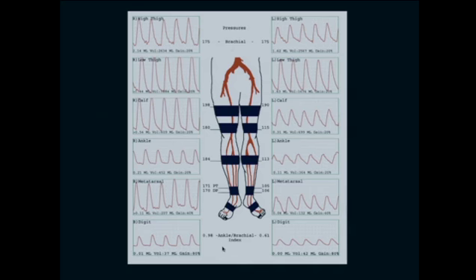In this patient, we see that the ankle brachial index on the right is 0.98, which is close to normal, but there is a significant reduction in the ankle brachial index on the left, which is seen here to be 0.61. When we review the segmental pressure measurements, we can see that there's a significant reduction in pressure across the left thigh level, and pressures remain decreased as we move down the lower extremity. We also will observe that there's a decrease in amplitude in the pulse volume recordings as we move from the thigh to the calf level, indicating to us that there is likely a significant lesion at the femoral popliteal level.